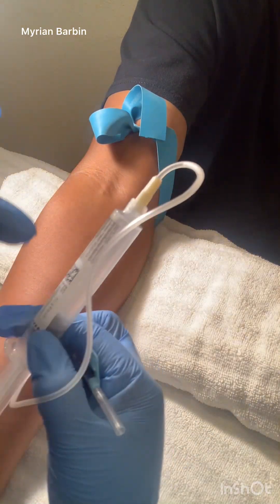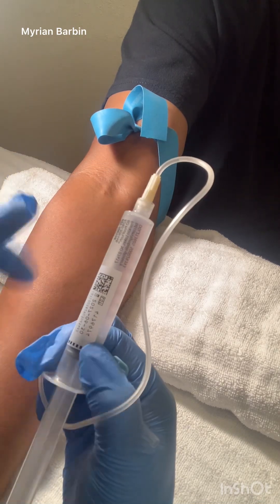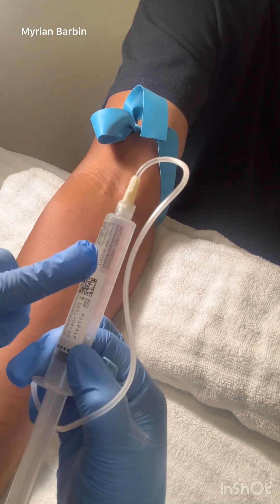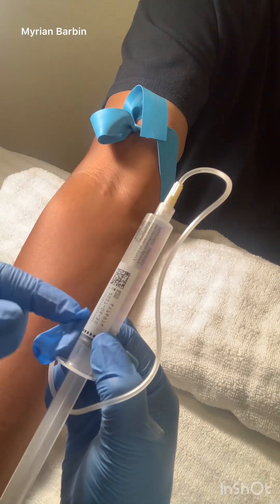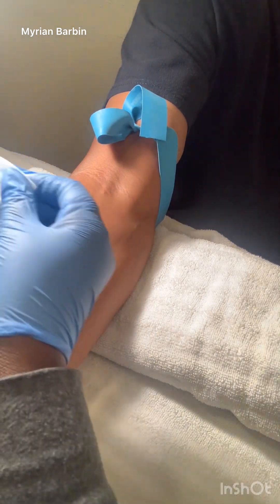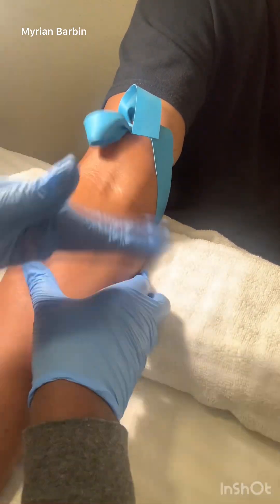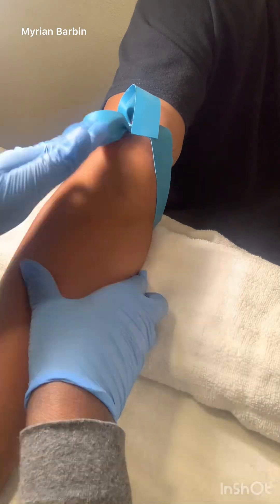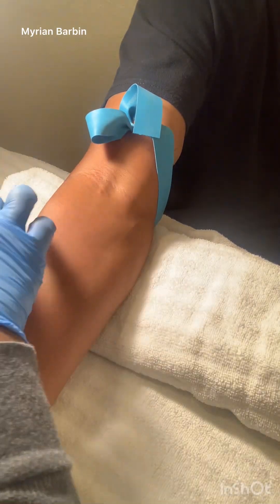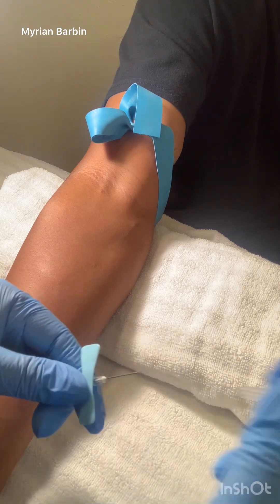Here's the needle I'm using — I have the syringe at the end, so this is saline. I'm not going to inject the saline; this is a demonstration for if you had to draw blood. Make sure you clean the area with the alcohol pad, cleaning in a circular motion. Make sure that you are drying it, then take the top off.